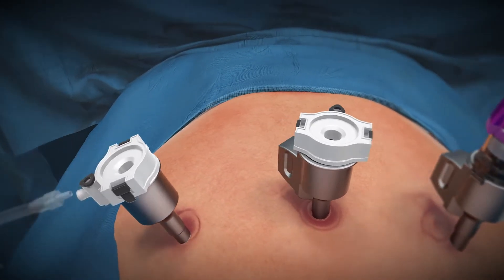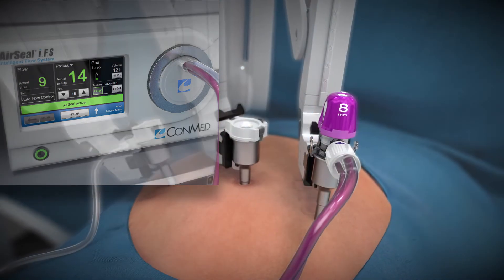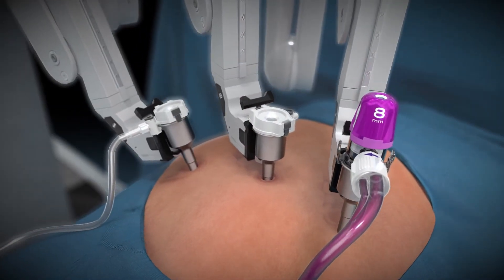Once the connection has been made, AirSeal will start automatically. Allow 10 to 12 seconds for AirSeal to activate. Once AirSeal is active, the obturator can be removed.